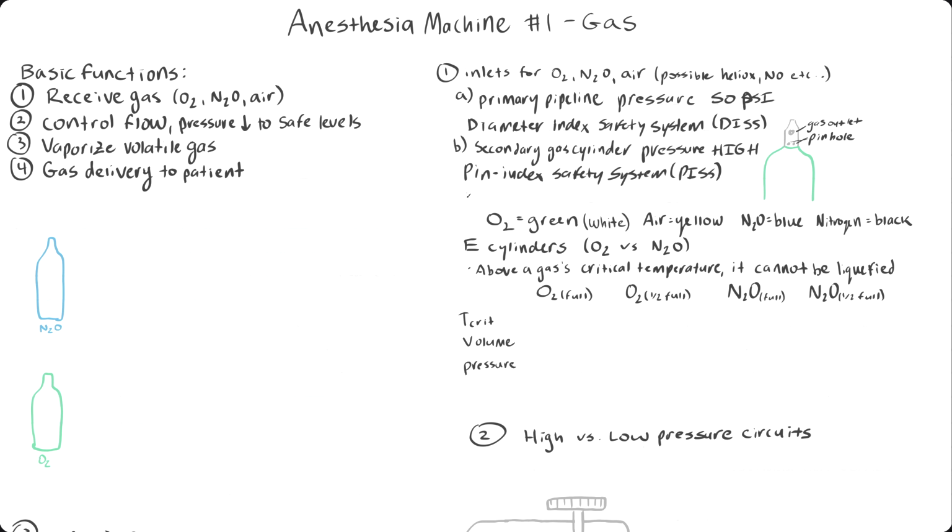For the gas cylinders, again, there's a color coding system, which is as follows here in the US and Canada and UK in brackets. The main difference being in the US, your oxygen is going to be green, your O2 lines are green, whereas they are white in Canada. Our E-cylinders are also still green though.